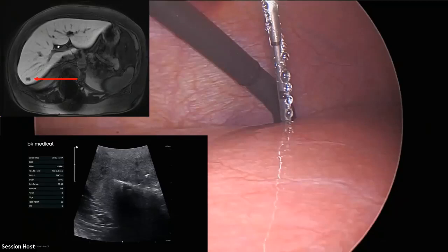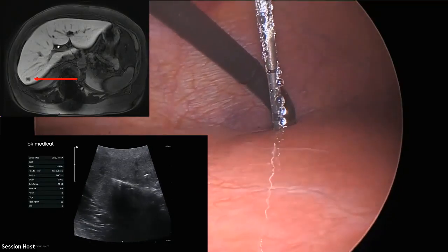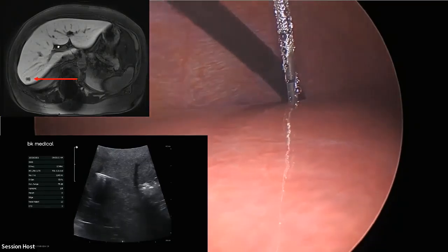And we don't have to run through all this because you're going to get the point, right? Same setup, different tumor. This is a little bit in the posterior 6/7, same idea.